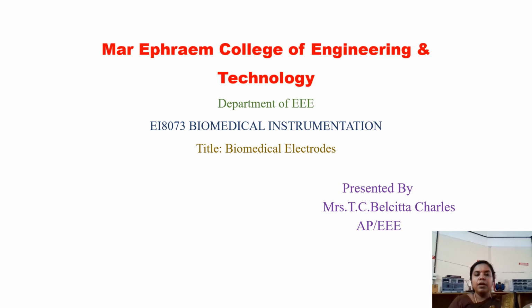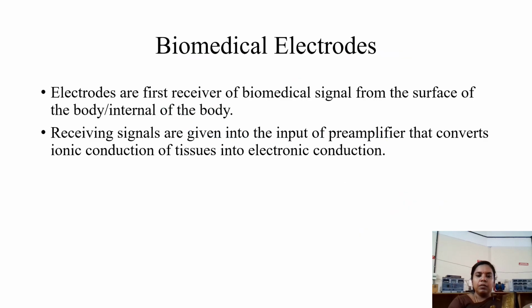Good morning everyone. In this video we are going to discuss a topic from the course Biomedical Instrumentation. The title is Biomedical Electrodes. So first of all, let's know what is an electrode.